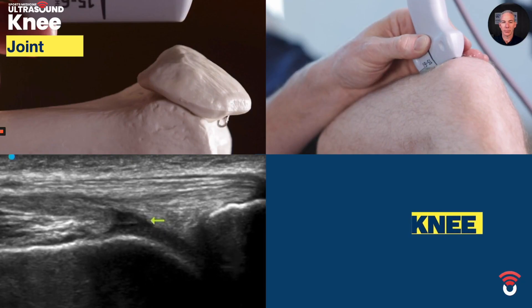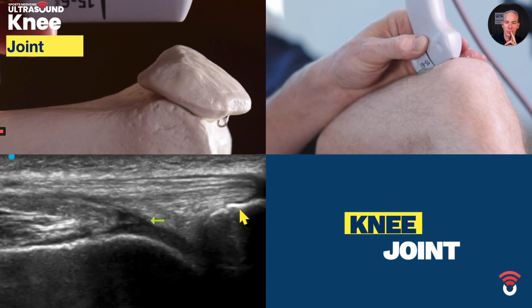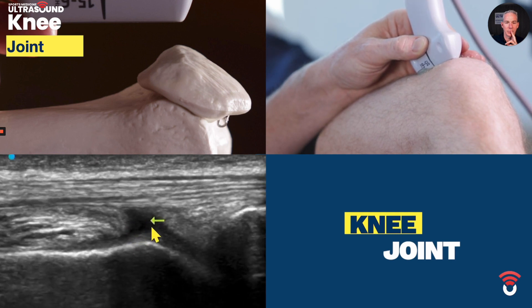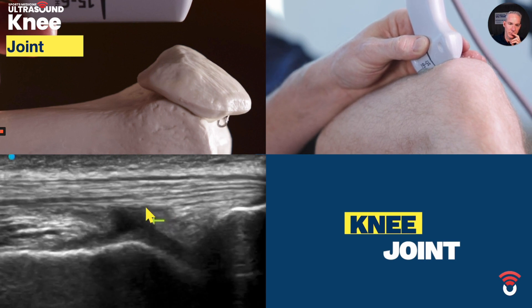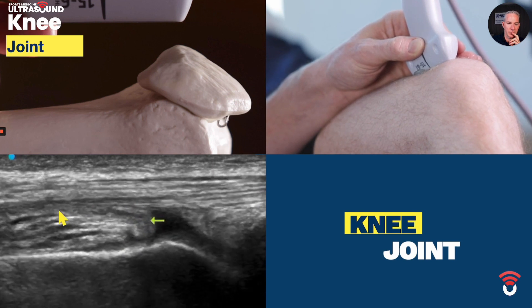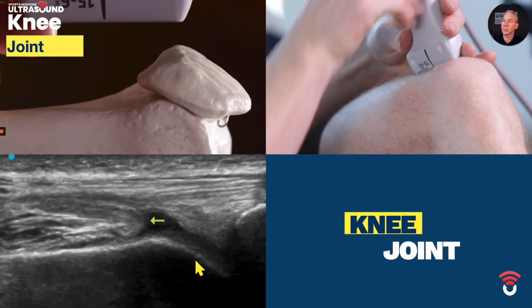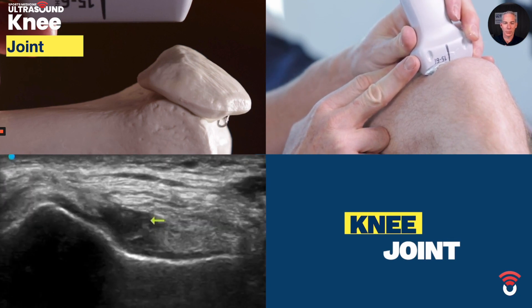My landmark is going to be the patella — you can see that on the top right view of the screen. The orientation of the probe is long axis on the femur. My area of interest is in the center of the screen highlighted by the yellow arrow. The yellow arrow is now over the suprapatellar fat pad, and now over the pre-femoral fat pad. So the joint fluid recess we're looking for is between the pre-femoral fat pad and the suprapatellar fat pad.